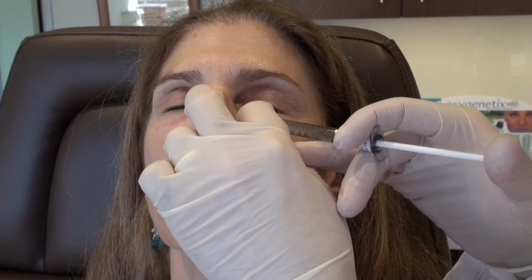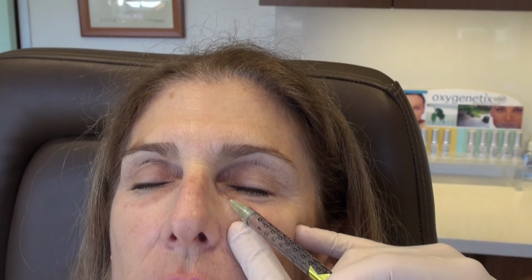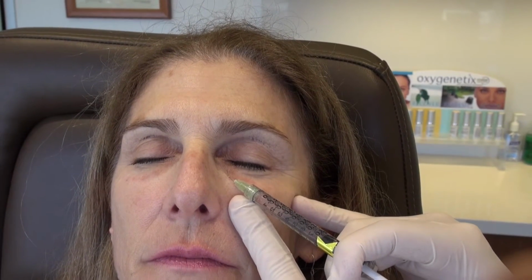Little stick here. Can you see that? Open your eyes. Come forward. That's a nice change. Little stick here.